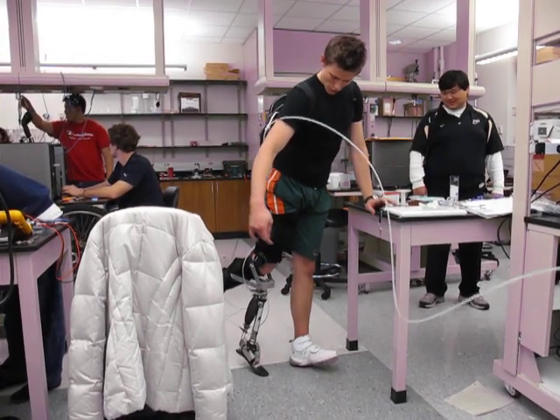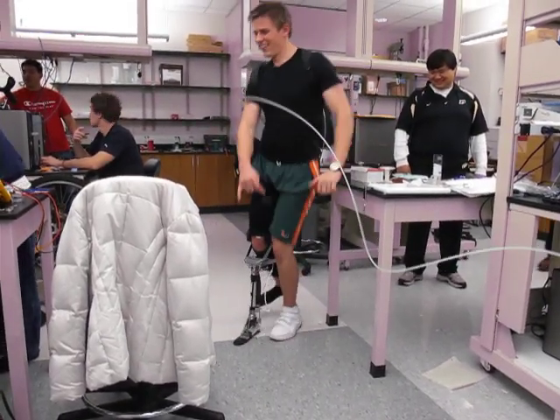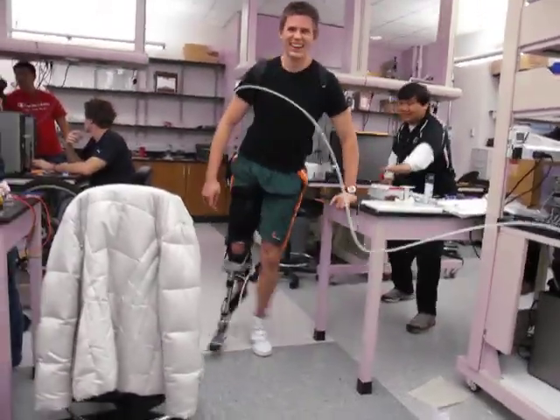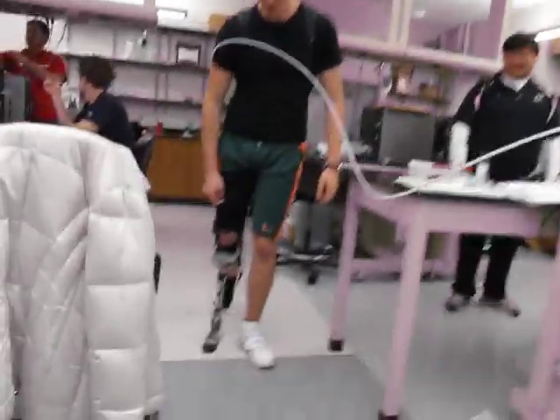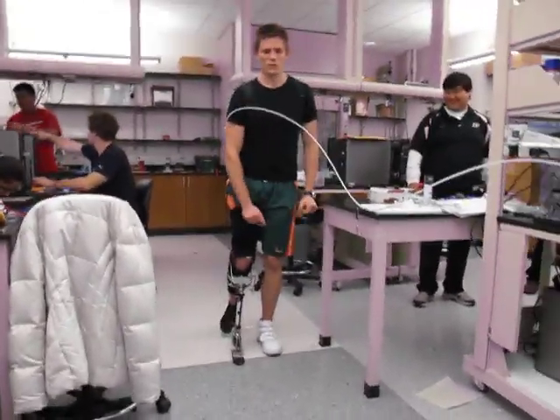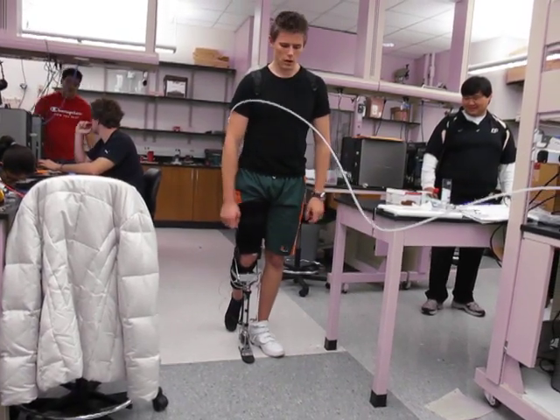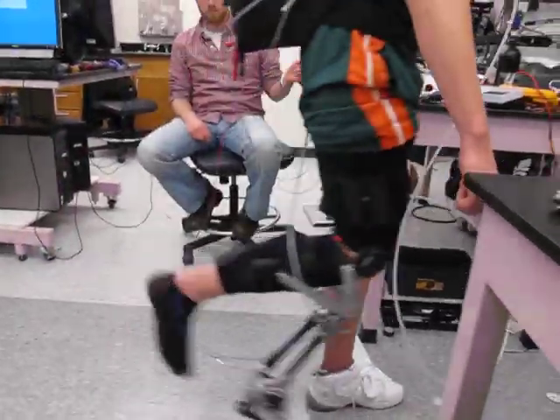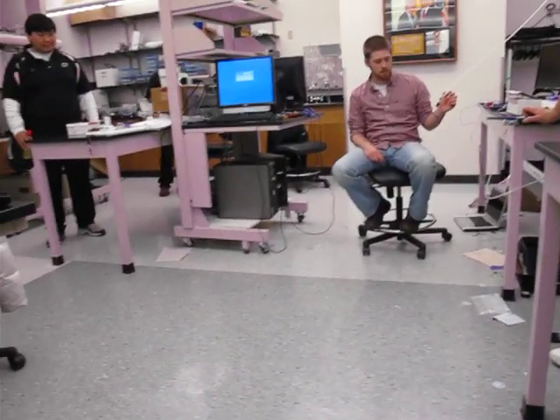He's liking it. Yes. Oh my god, dude. Actually do the other way. Yeah, there you go. I liked it. Alright, it's getting ridiculous. Let's try another walk in here. I didn't contract that time — that was weird. On your last time, yeah, it wasn't on the ropes.